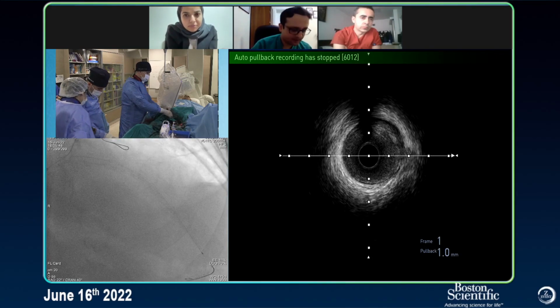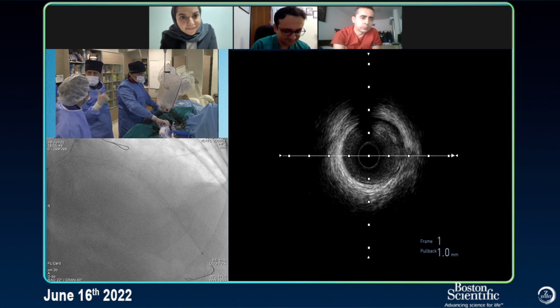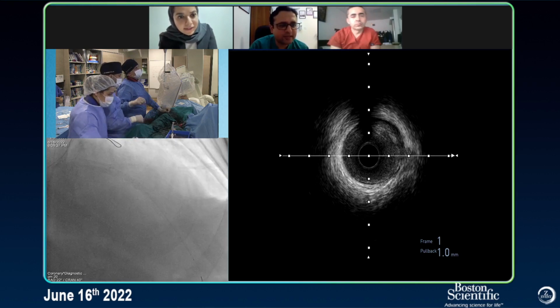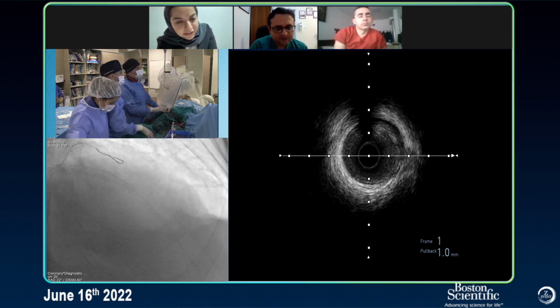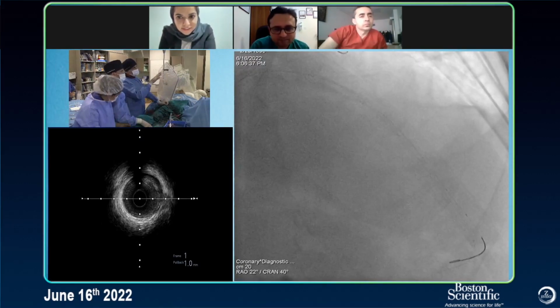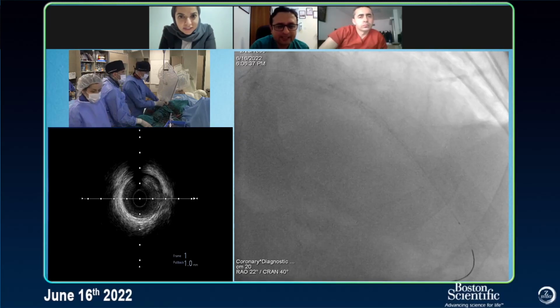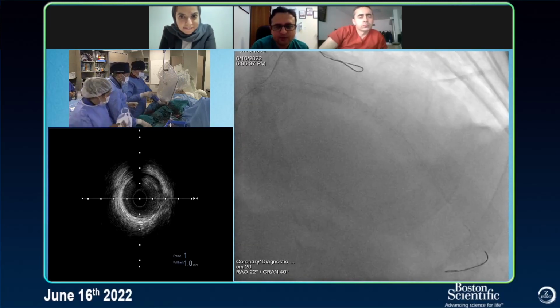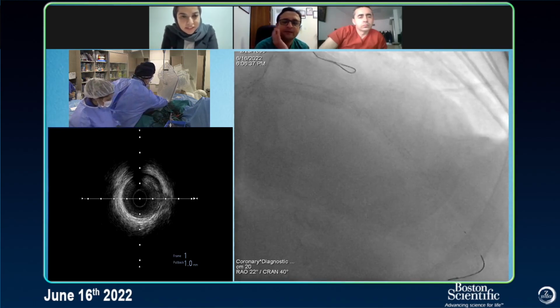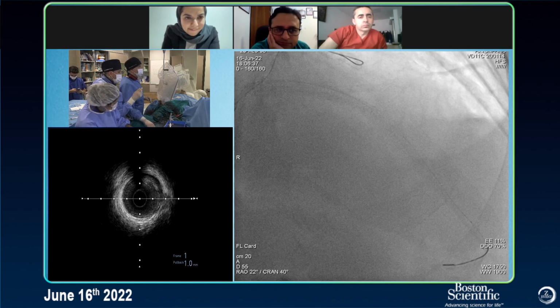Okay, below the diag. So, do you want me to hit that part 3.75? I think 3.5 at a high pressure. We went like 10 only. Ah, 3.5 with a high pressure. That part we did nicely, 3.5. It was still below the diag. I think below the diag we just went to 10, no? Above the diag we went high pressure. Just at once I went 10 and then easily I went 4.